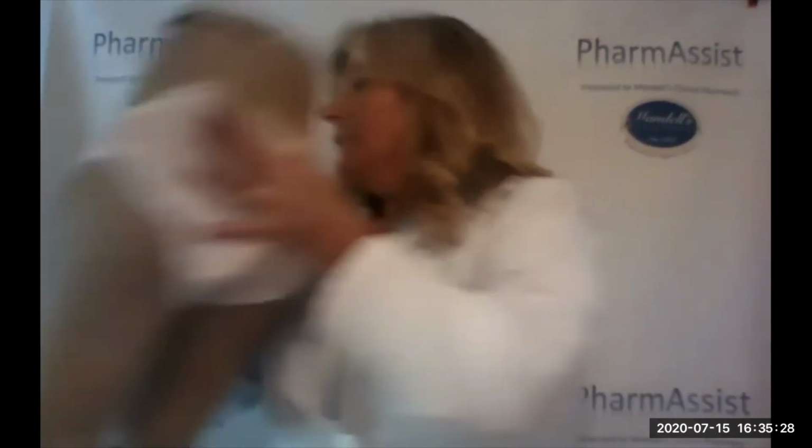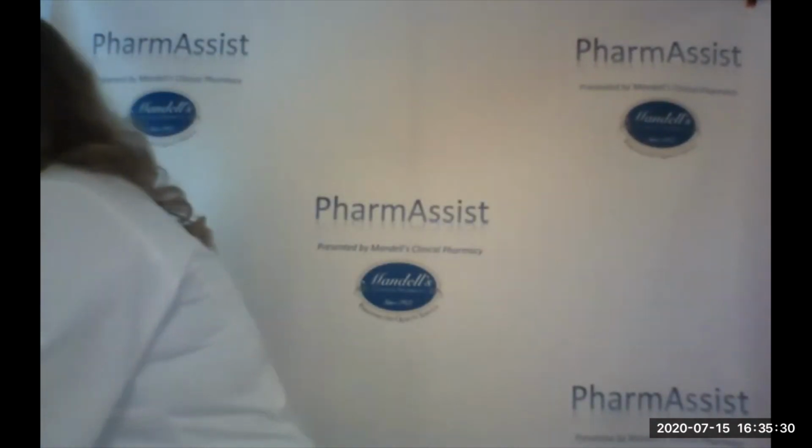With that multi-dose, the key thing to know is after you give that injection, what you are going to do is then put your vial in the refrigerator. And then on your next injection, what you can do is take it out. You could leave the vial on the counter for a few minutes, or you could draw up your dose and leave the dosage, just what you need, out on the counter for a few minutes using the syringe, several syringes that you have. Because remember, it's a multi-dose vial, but you have many syringes so that you can do more than one injection.